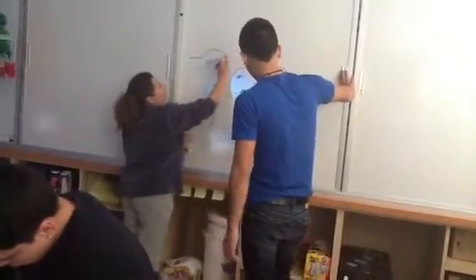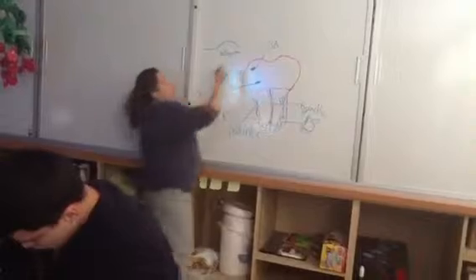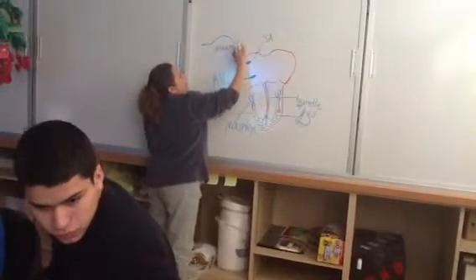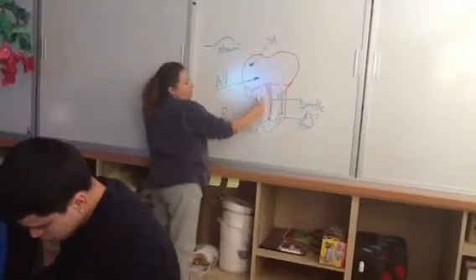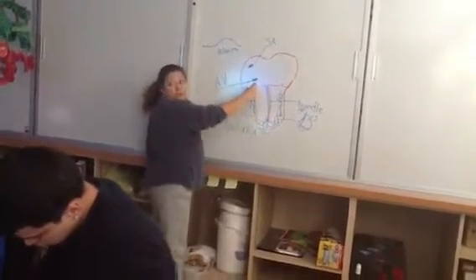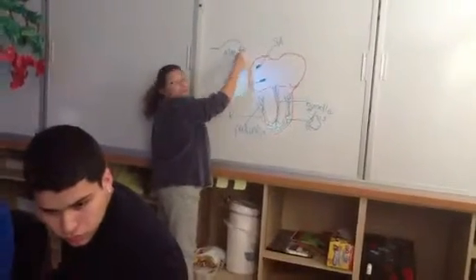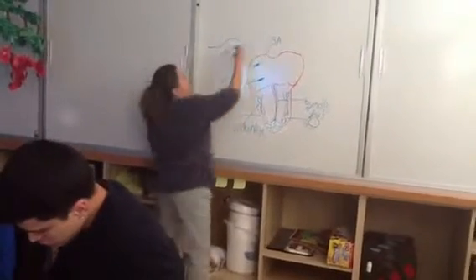So that's your atrium contracting. That first hump. The second, it'll be short, and then it'll be really short. So then when your ventricles pop, when the AV node starts to contract, that starts your contraction for your ventricles. So it triggers this bottom half to contract, and that's what you get, the peak.